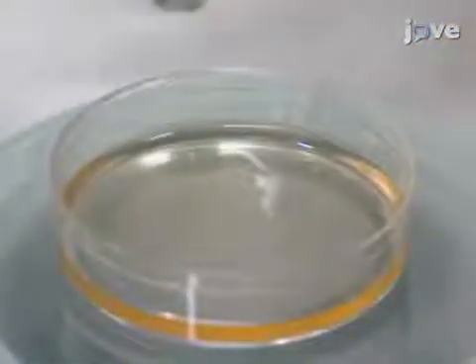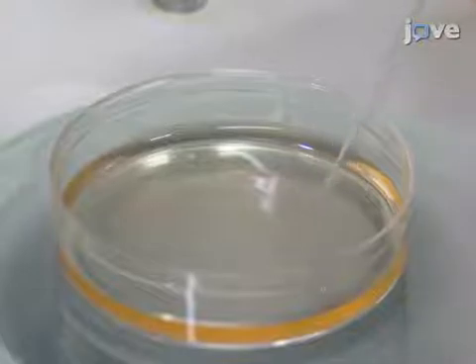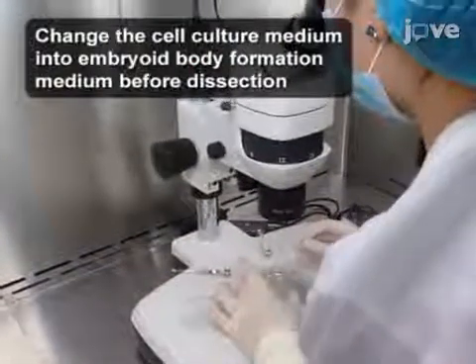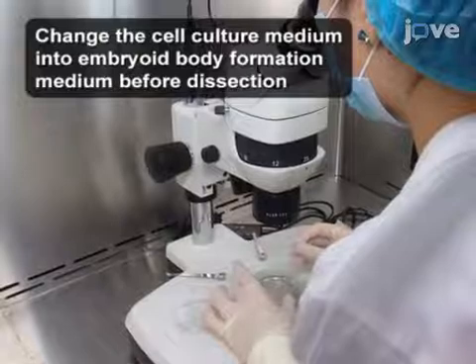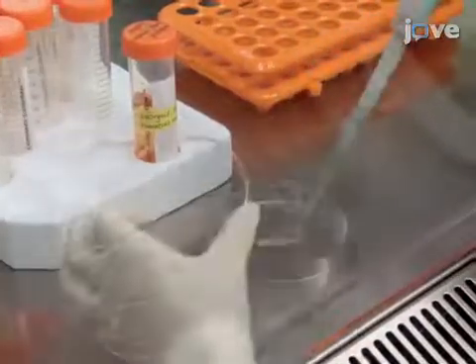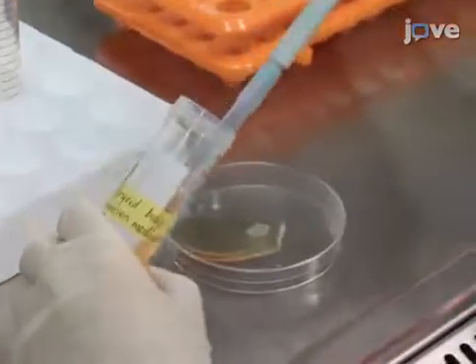After 2 to 3 passages, use a fire-drawn glass needle to dissect the 80 to 90 percent confluent, undifferentiated iPSC colony into smaller fragments, and transfer no more than 100 cell culture pieces into a new non-adherent 100 mm petri dish containing 10 mL of embryoid body formation medium.